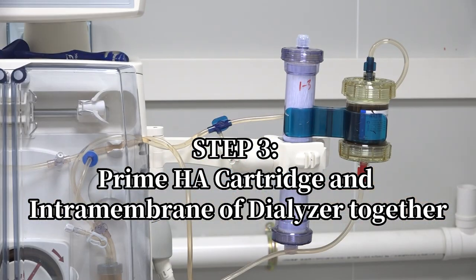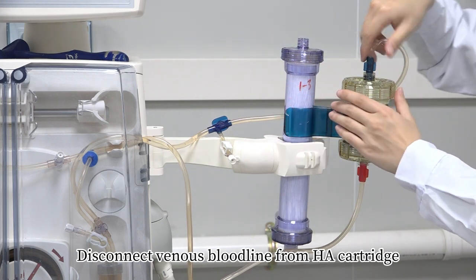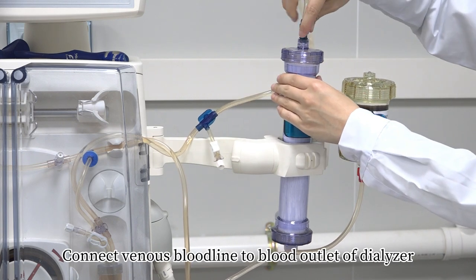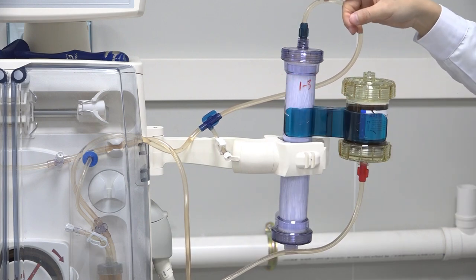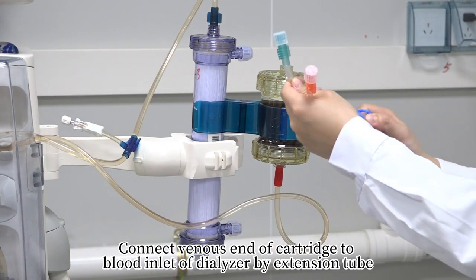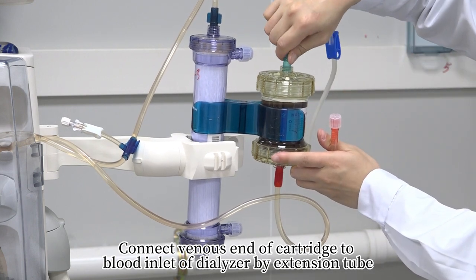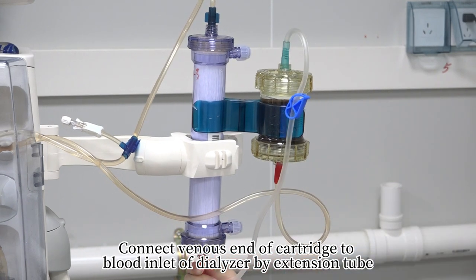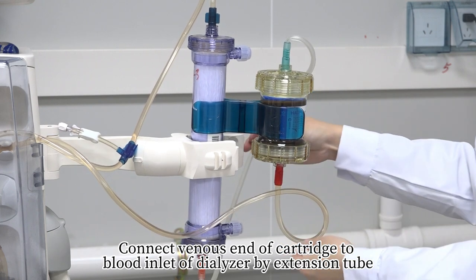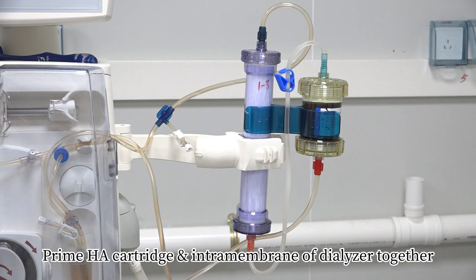Step 3 – Prime HA cartridge and intramembrane of dialyzer together: Stop blood pump. Disconnect the venous bloodline from HA cartridge. Connect the venous end of cartridge to blood inlet of dialyzer. Start blood pump and prime HA cartridge and intramembrane of dialyzer together.